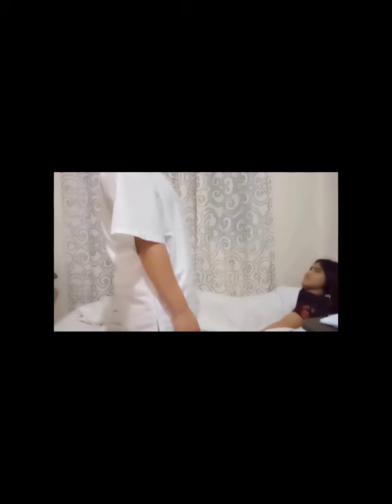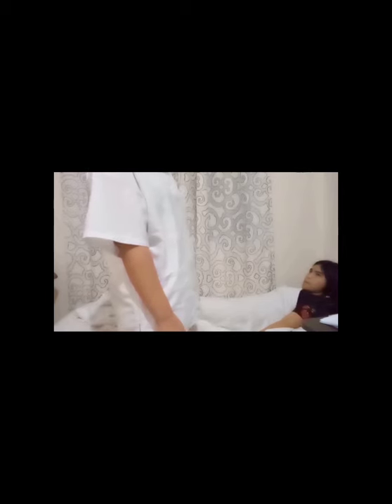Everything you want. So, Romuline, the procedure that I will be doing is urinary catheterization, based on the physician's order. This will help relieve your urinary retention. Of course, I will touch some parts of your body. Is that okay with you? Yes.